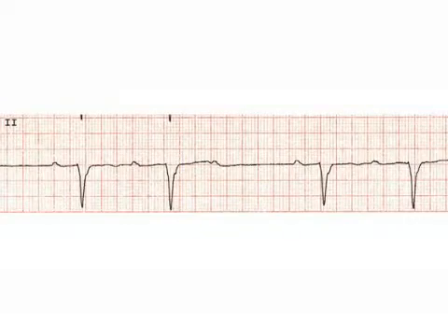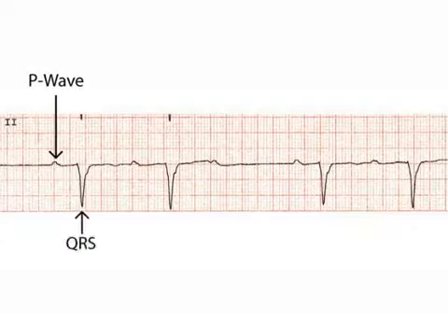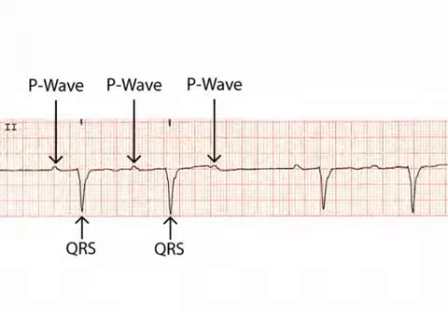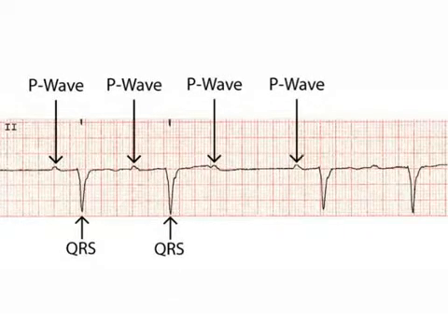Yeah, with the next tracing, the student again might want to try to take a look at this first by themselves. Looking at it, you'll see that there's a P wave, QRS. The T waves are somewhat difficult to see on this strip, so don't worry about that. But then comes another P wave, a QRS, and then I think you can see a P wave going to another P wave. So there appears to be a pause and a block there.